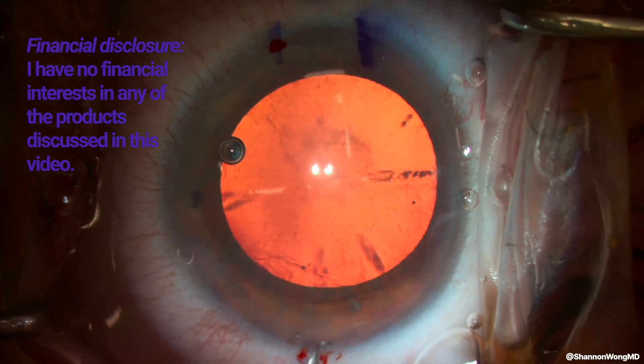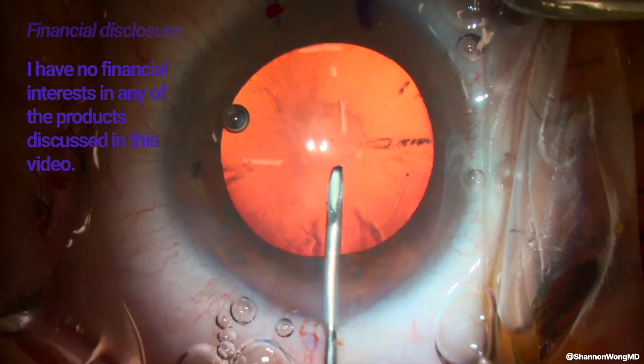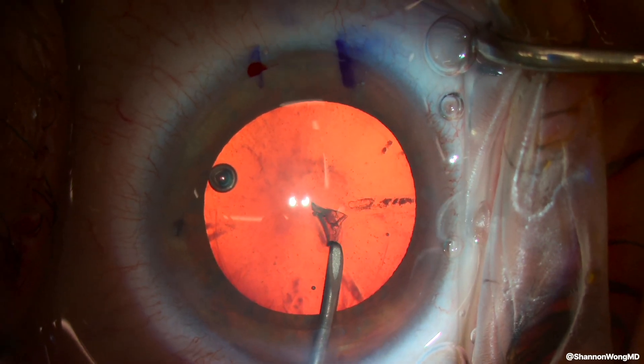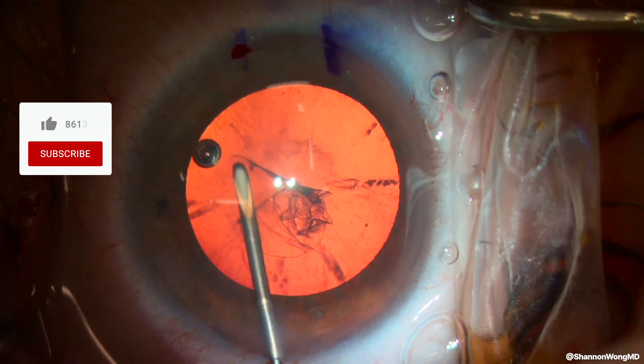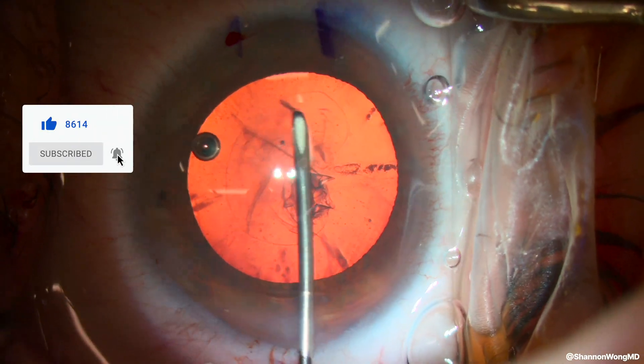It's routine cataract surgery and we're about to perform capsulorhexis with our cystotome attached to a syringe of OccuCoat Viscoelastic, and we proceed to create a 5mm opening in the anterior capsule. As the anterior chamber begins to shallow, we push more viscoelastic through our cystotome.